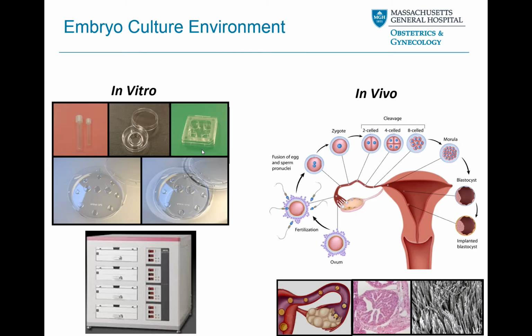So a couple things to note: throughout this entire process, every time we have a semen specimen, or eggs that are collected, or we put them together for fertilization, or we're developing these embryos, we do one patient at a time. And for every single step along the way, we have at least 2 people that double verify every step and make sure that we are tracking these cells perfectly. So when you look at an incubator like this, it's one patient at a time. We never share.